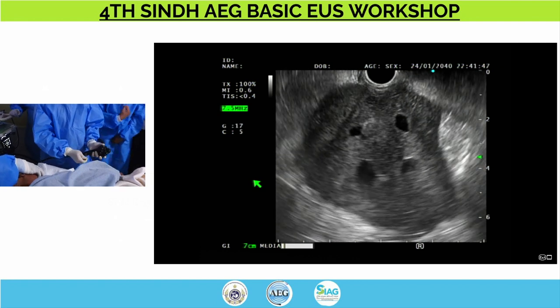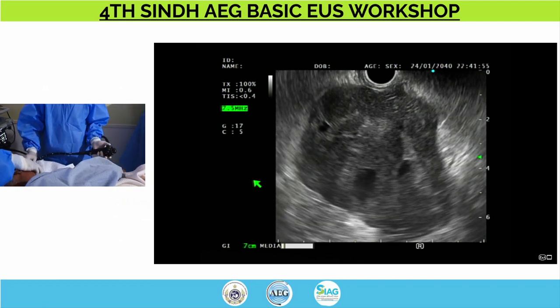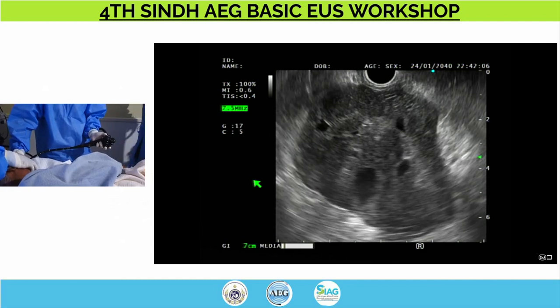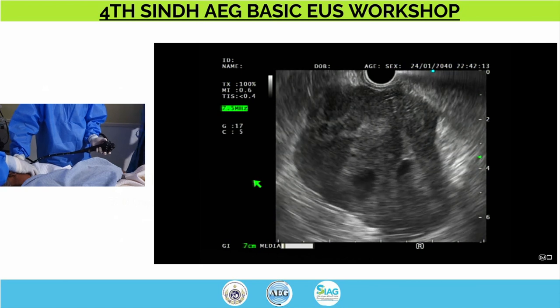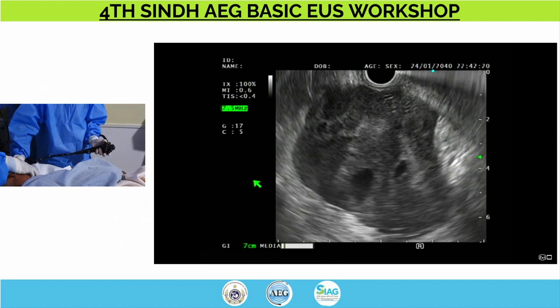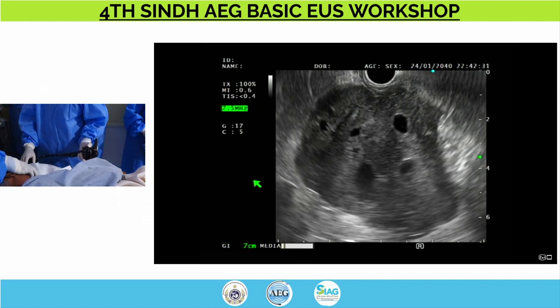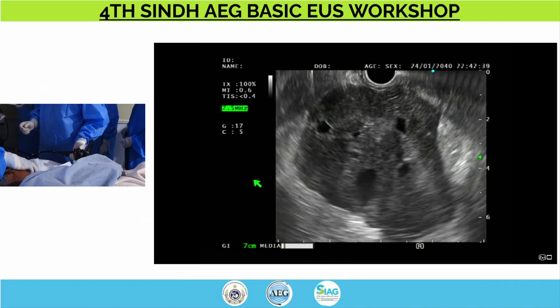I agree with everything you said. Whenever you see a mass like this, a 22 gauge FNB. One thing is you look at the size: big, more than 2 centimeters or more than 3 centimeters. Then you look at the EUS appearance, and whether there are any vacuoles or cystic components. If there are cystic components, heterogeneous, more than 3 centimeters, and the outer surface is irregular, all these are features of an advanced condition. So it could be a problematic kind of risk, which needs to be surgical versus medical. In this case, there are no metastatic lesions, and that is the problem with the surgery.